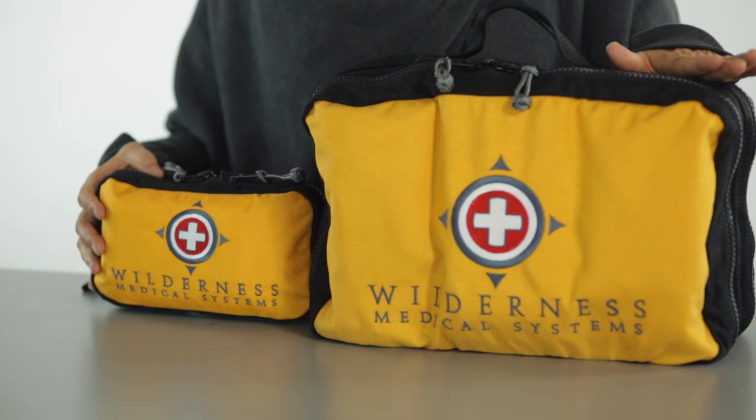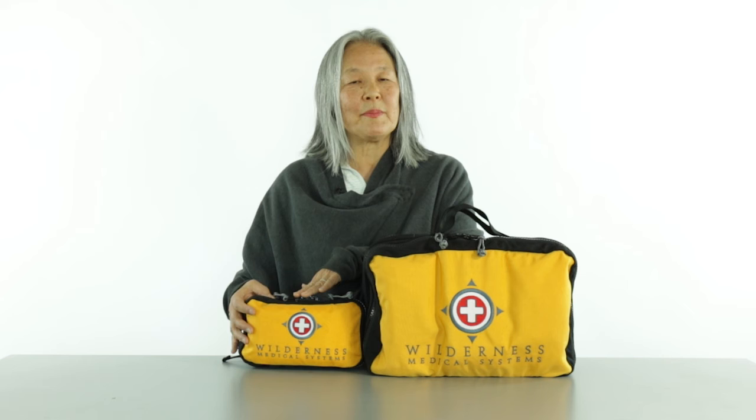Pairing the Mayfly with the Pamir allows you to take the Mayfly in your backpack, in a jeep, or in a car, and have the Pamir in your base camp or home to allow you to refill if you use things from the smaller kit, but also give you the greater capability that is possible in a bag that large.